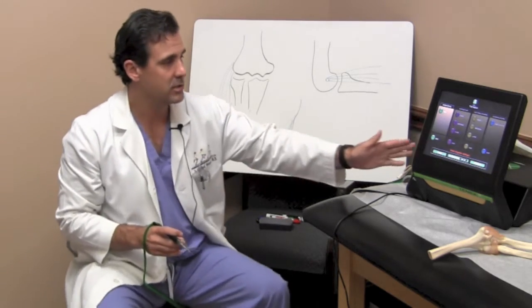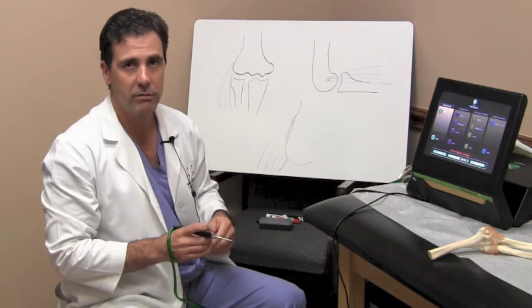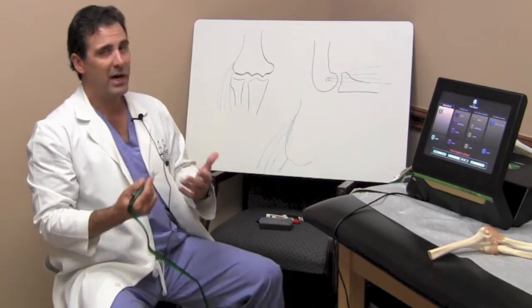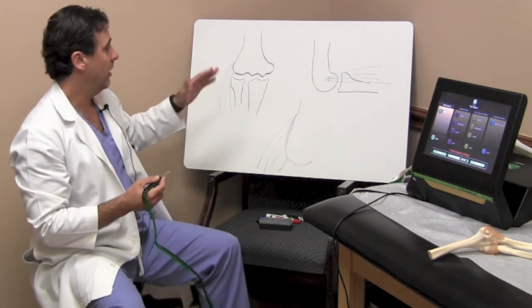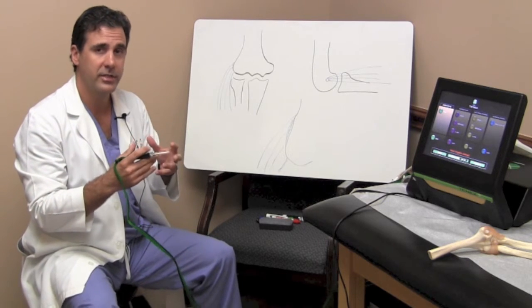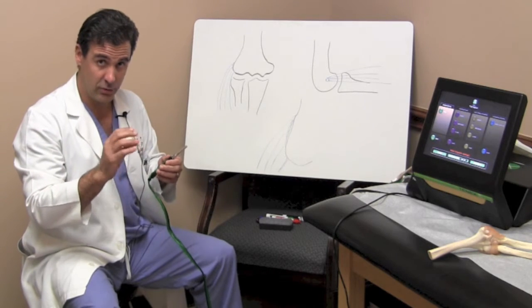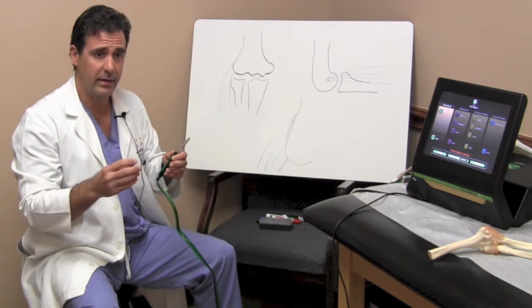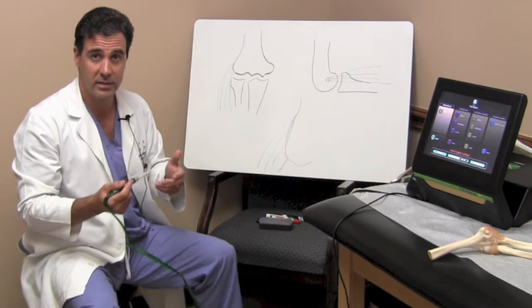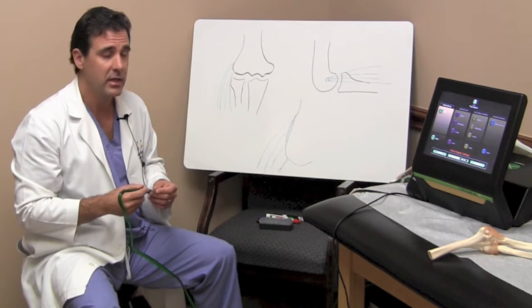This is the console itself, which gives us the setting and the cutting power for the device. With this specific device, it's nearly impossible to damage the healthy tissue because it only really breaks up the degenerative tissue, because of the ultrasonic frequency. It vibrates and creates a fragmentation of the diseased tissue, whereas the healthy tissue doesn't respond in the same way. So that's another benefit.